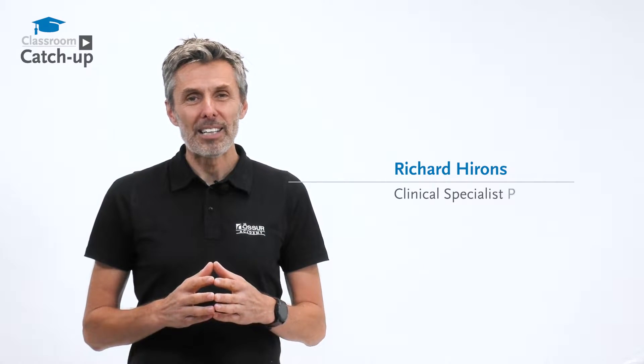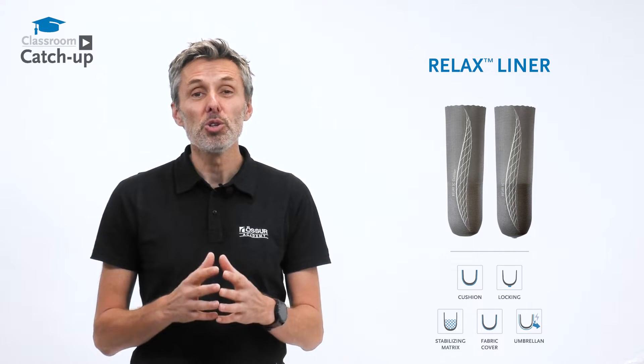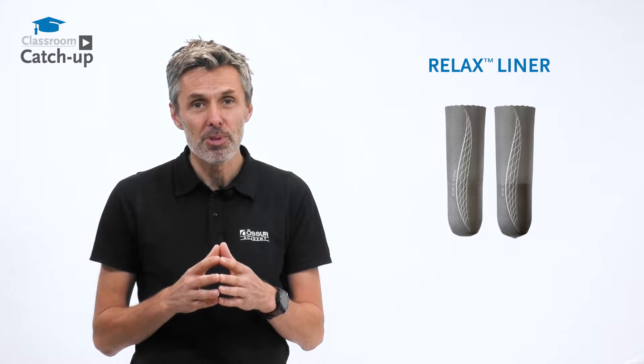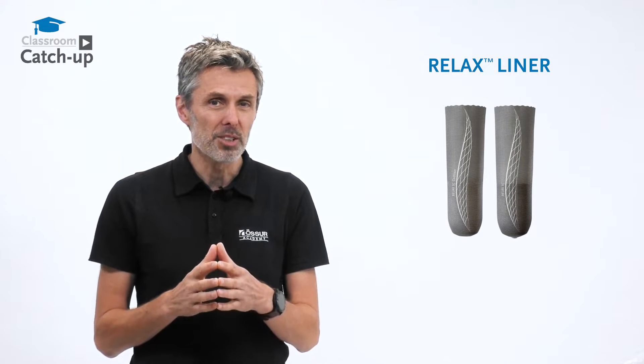Hello, I'm Richard, clinical specialist prosthetist for the Osser Academy, and today we're talking about Osser Relaxed Liners. Users have a choice of many different types of interfaces for a huge variety of reasons. One of those reasons might be for the management of phantom limb pain. The Osser Relaxed Liner is designed specifically to help with that.